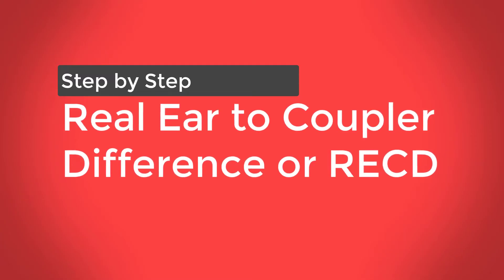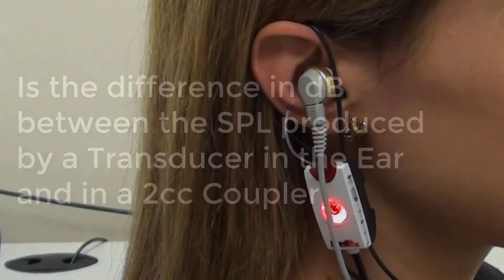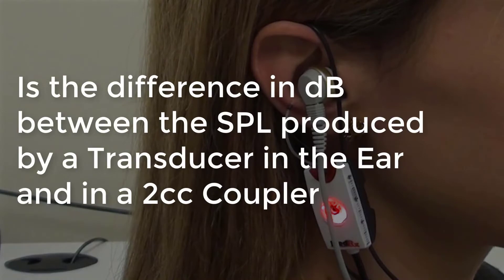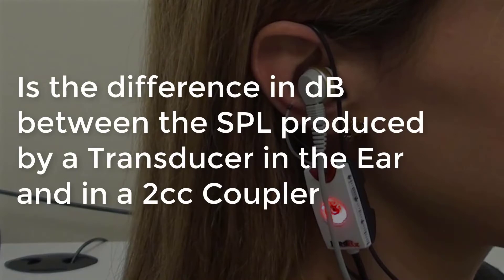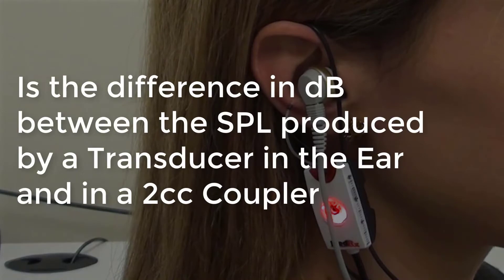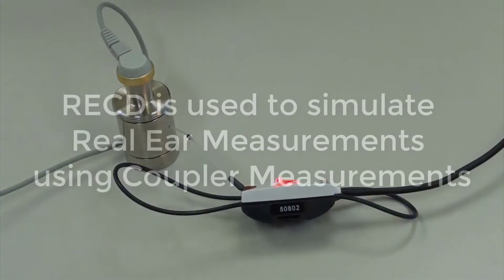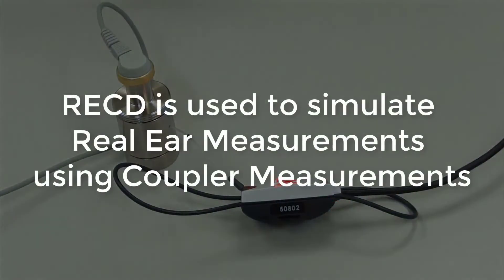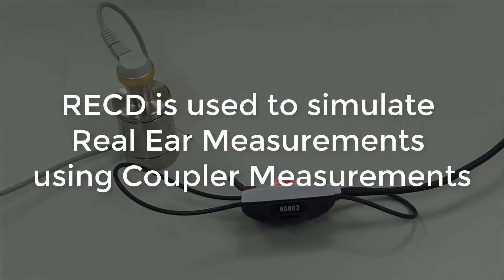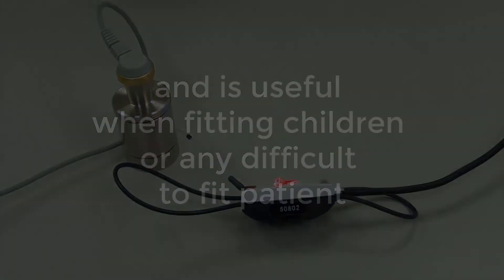Real Ear to Coupler Difference, or RECD, is the difference in dB between the SPL produced by a transducer in the ear and in a 2 cc coupler. RECD is used to simulate real ear measurements using coupler measurements and is useful when fitting children or any difficult-to-fit patient.